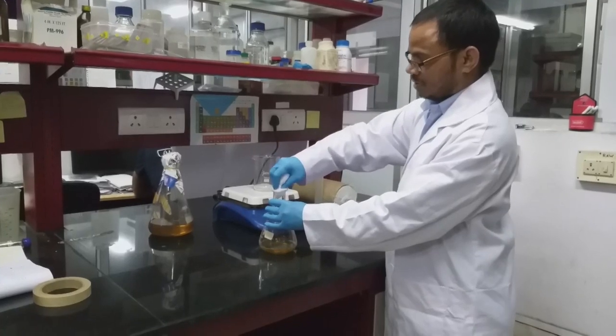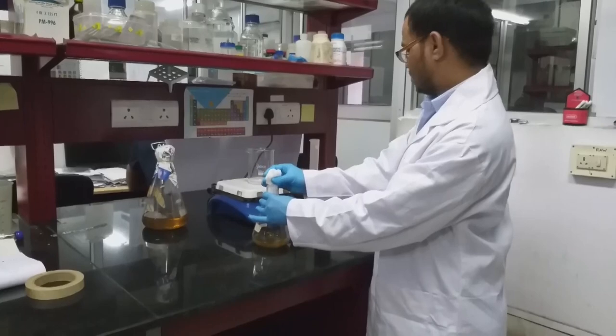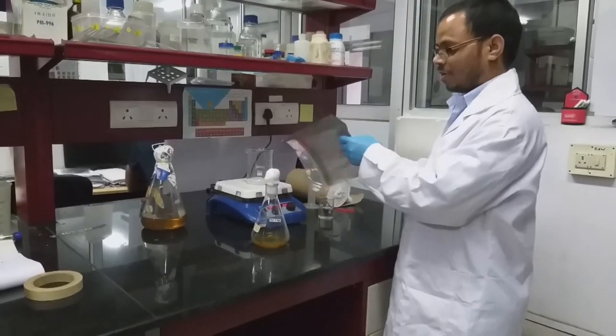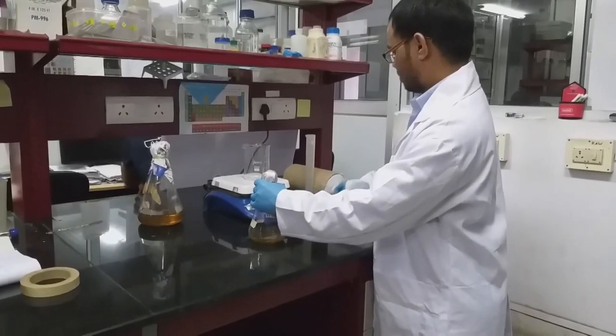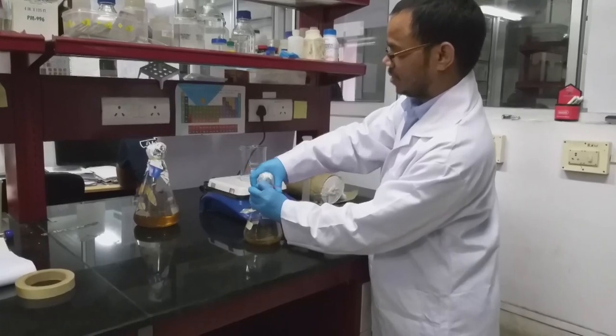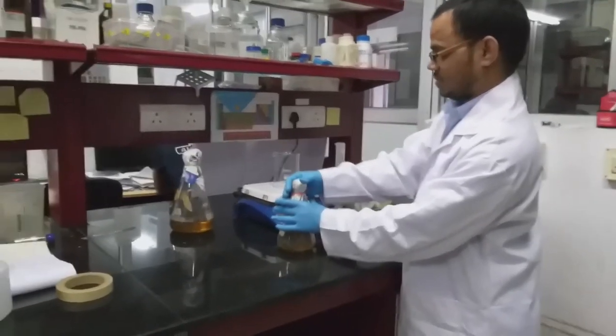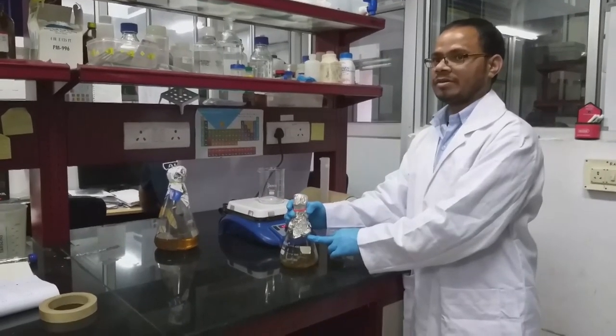Cap the mouth with cotton plug and wrap this aluminium foil tightly with a rubber band. Now this is ready for autoclaving.